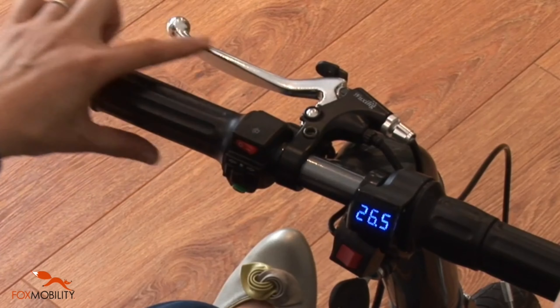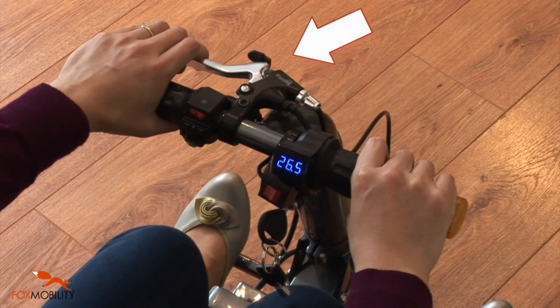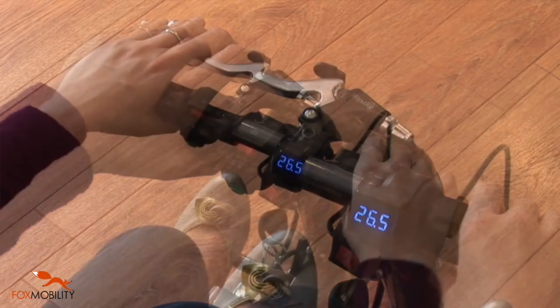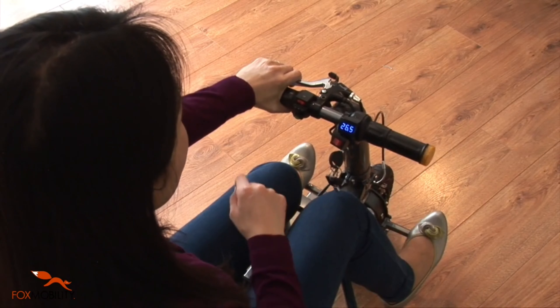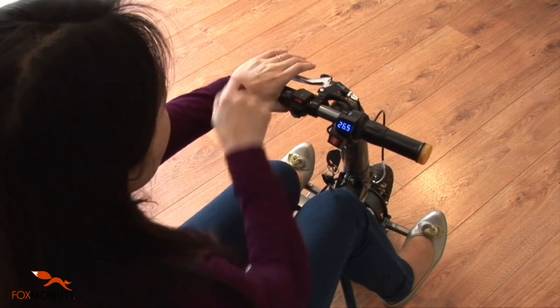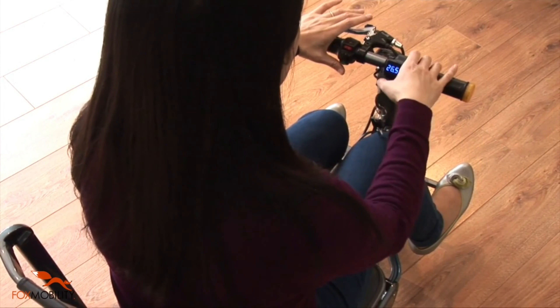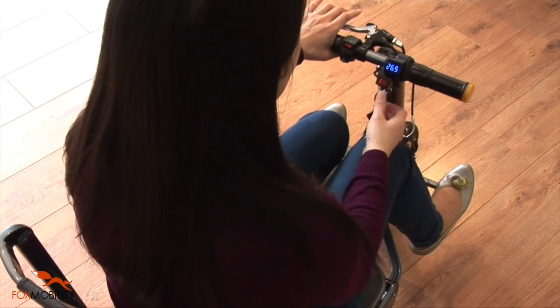The handbrake is located on the left handle, completed with a handbrake lock. When applying the handbrake, the power to the motor will be cut off automatically. Pressing the handbrake lock will keep the eFoldie stationary on the ground. To change between the different speeds and travel directions, please apply the handbrake and wait until the eFoldie has come to a complete stop.